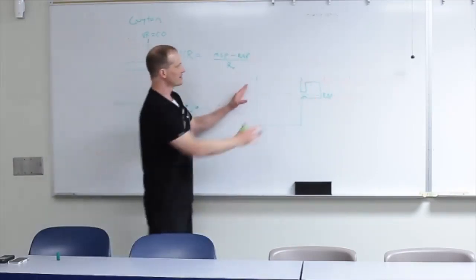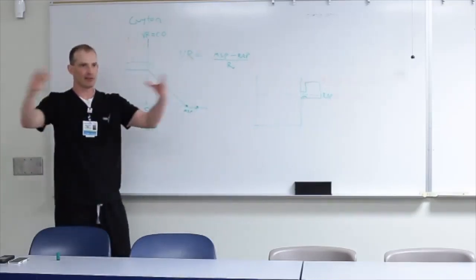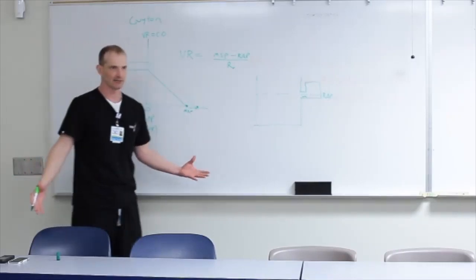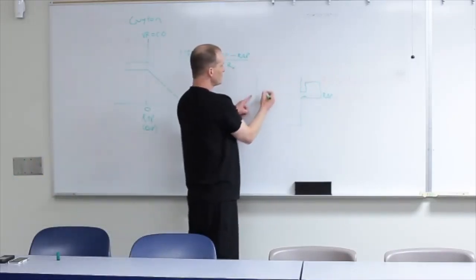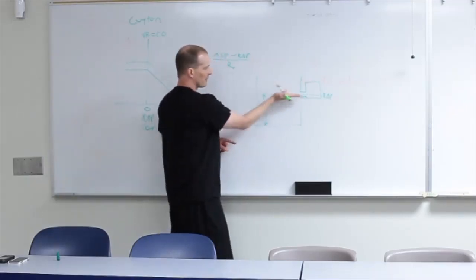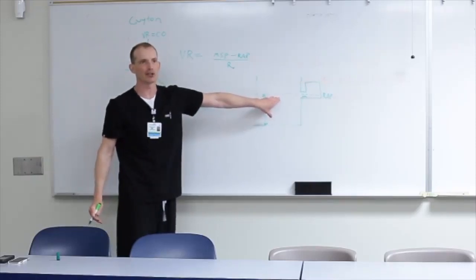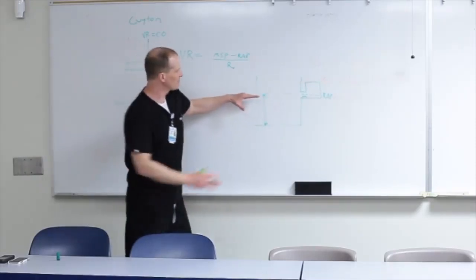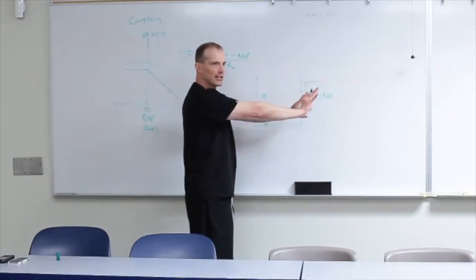And here is the vein, the whole sum total of the volume of blood in the venous side. Okay? And so this, from here to here, anything that's not raising pressures above the right atrial pressure is just sitting there. This blood is not going to go anywhere. There's nothing pushing it in.